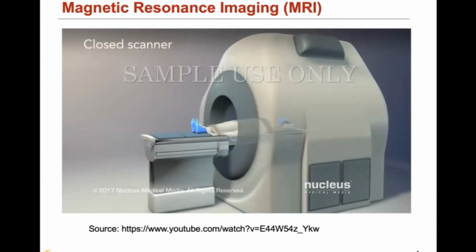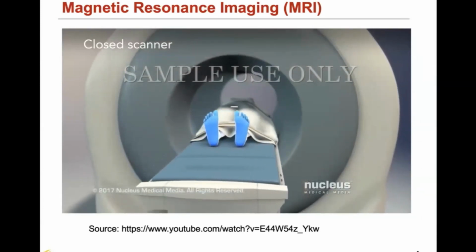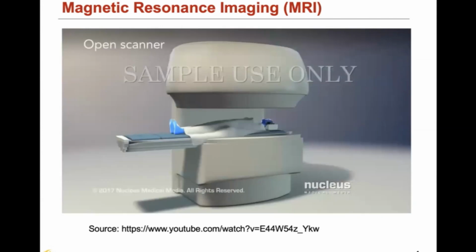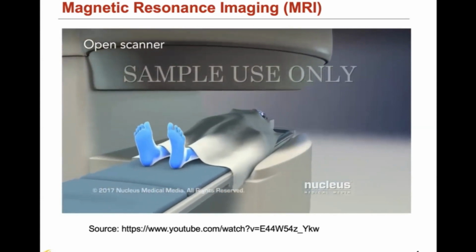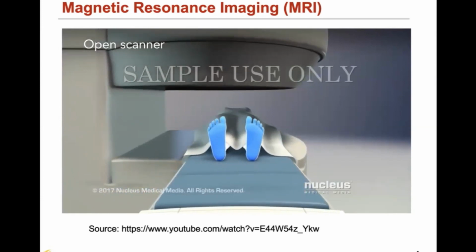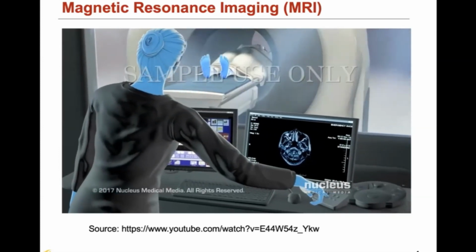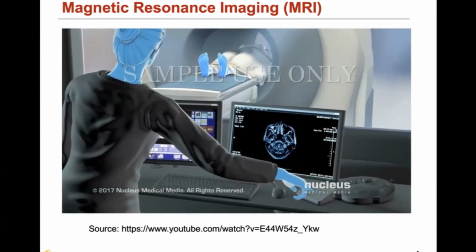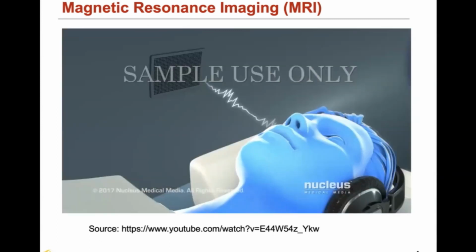Most often, closed scanners, such as this one, are used. The area inside is very narrow. In some areas, open scanners are available. This scanner is open on the sides, so you won't be completely surrounded by the machine. However, the pictures may not be as good as with closed scanners. For either type of scanner, a technologist will operate it from the next room. You will be able to talk to each other through a two-way speaker.